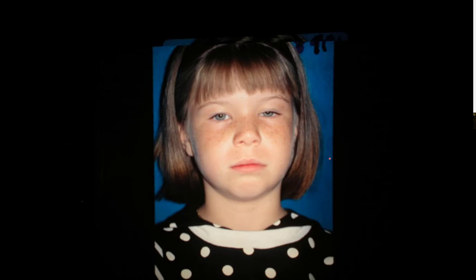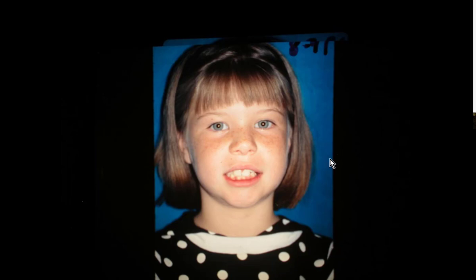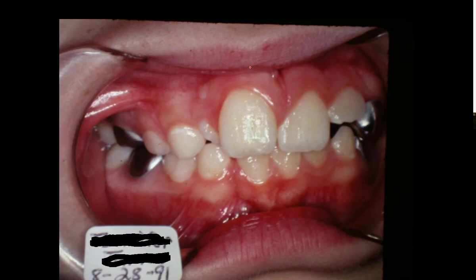I'll go as fast as I can — there are a lot of pictures to go through. Her smile is nice; she doesn't show a lot of gum tissue, so this is good. Now this supernumerary tooth — we just drew it in. Actually, it's a little higher up than shown here, and we'll see it on X-rays in just a minute. We'll see other things wrong with the case, but nothing terrible.